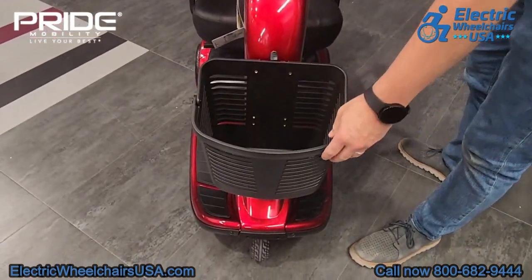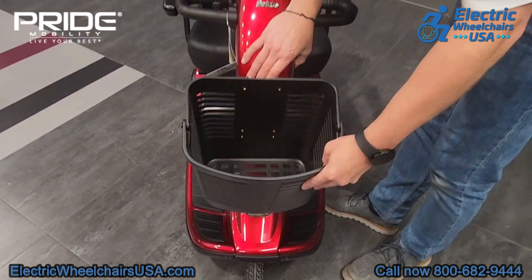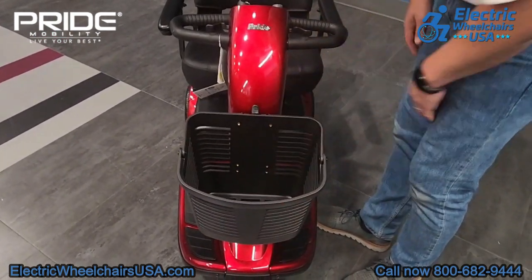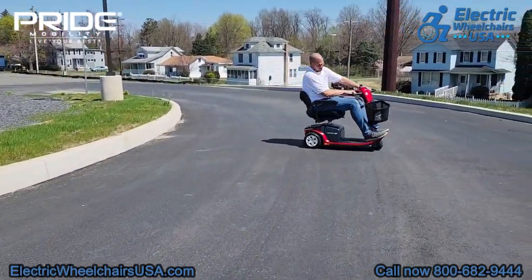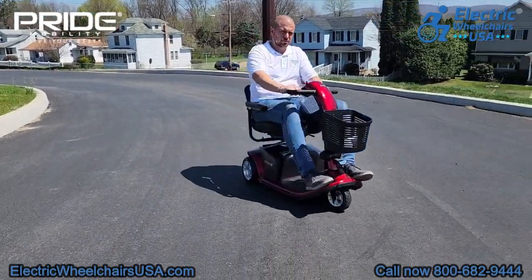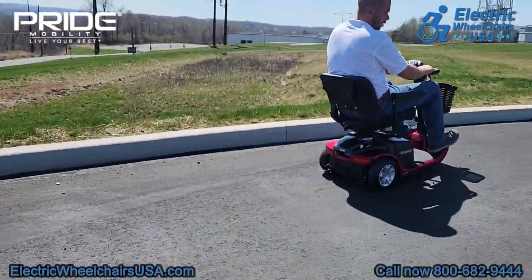The front basket can also be removed if you wanted to take it with you to go shopping, for example. Another great thing about this scooter is that because it's a three-wheel design, the floorboard extends out, giving you more leg room. All around, the Victory 9 three-wheel is a great scooter — it's one of Pride's more popular models and truly a staple in the industry.